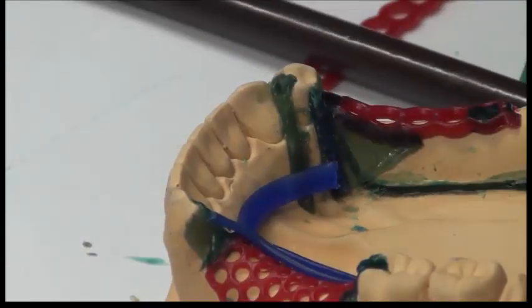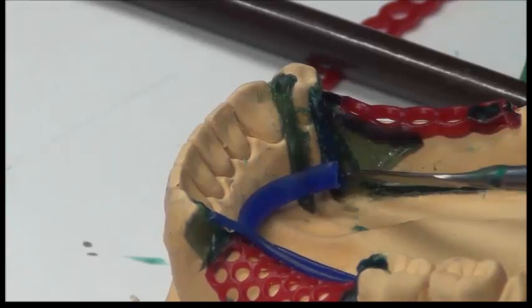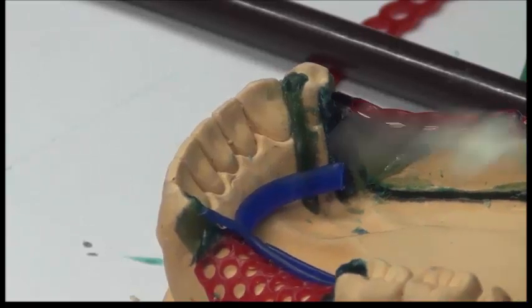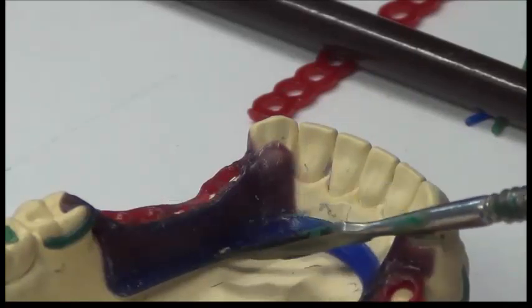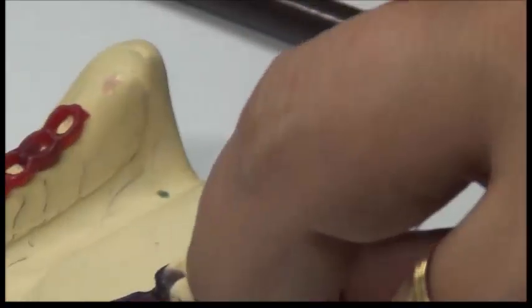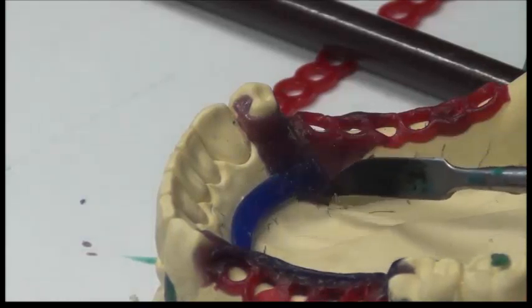And here, I have the same two options we said. Either we cover this with a plate and we join it with the lingual bar, or we simply join these components together with the lingual bar. So we preserve the lingual bar shape all throughout the length of it. Once we finish, we have the following smooth surfaces. You can see that I have smooth surfaces between the external finish line and the edge of the lingual bar. Here it's well adapted to the marginal gingiva. And on this side, you find it blending well. All wax parts are blended smoothly.